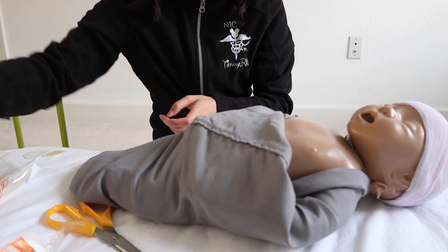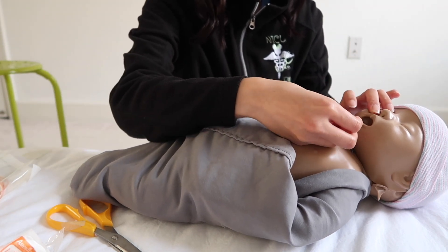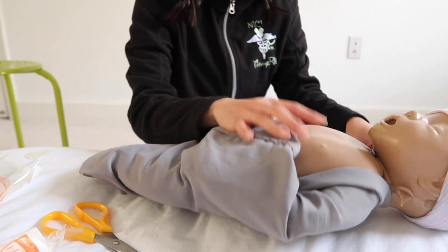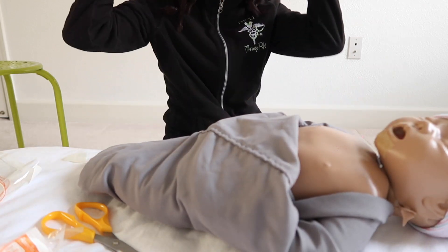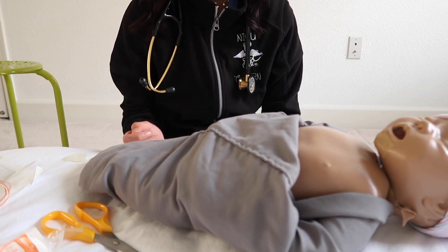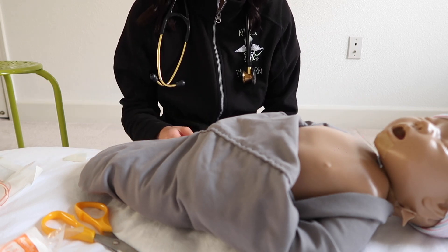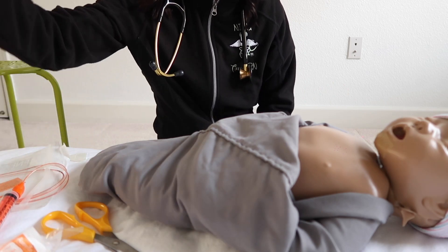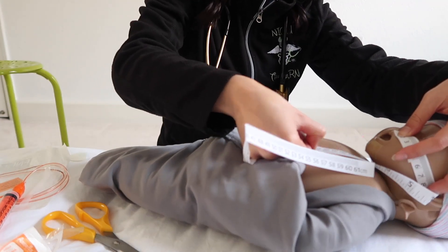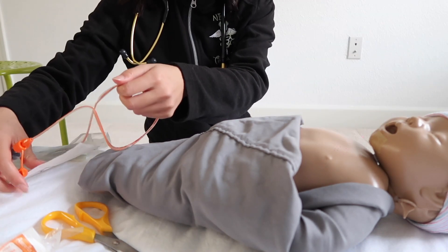The first thing I always do is stick the Duoderm on first — place it underneath the baby's chin, as close to the lip as possible but not on the lip. Have your Tegaderm ready and your stethoscope around your neck. There are two ways to confirm placement depending on your hospital policy: some places check pH, others auscultate. I'll show both options. Based on our measurement, we're inserting to about 23 centimeters.